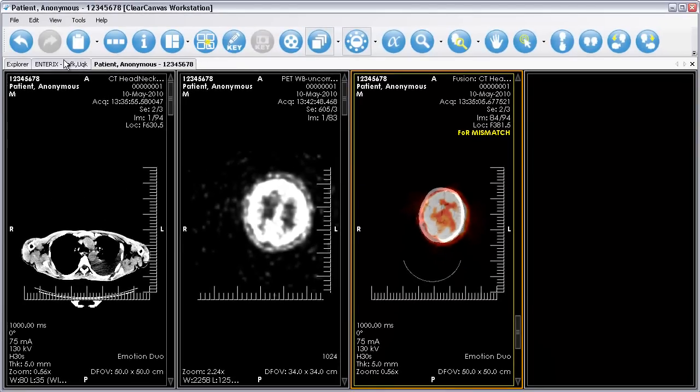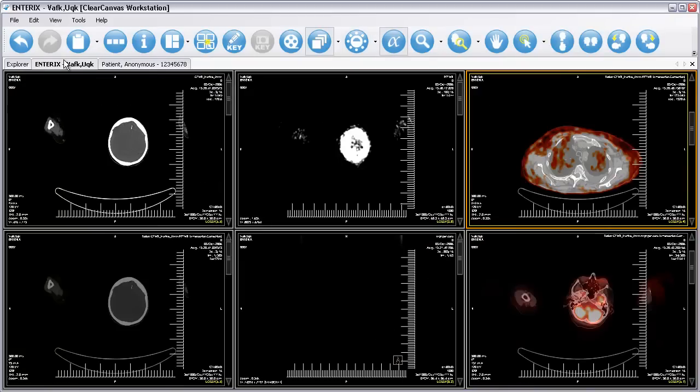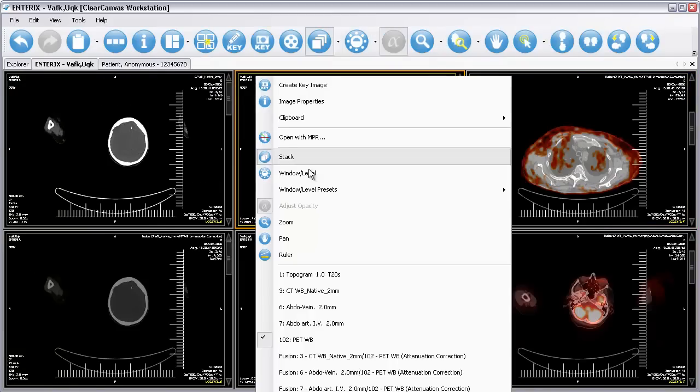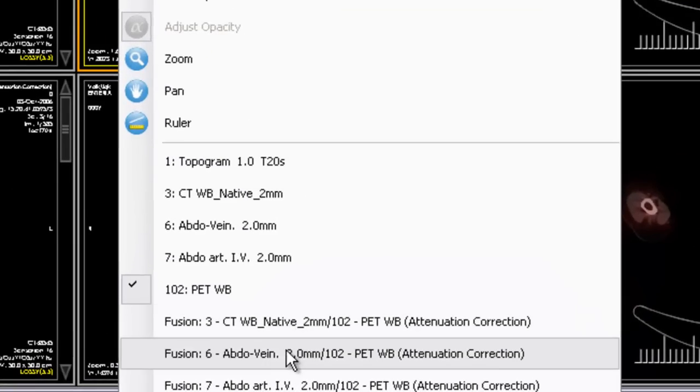Multiple PET and CT fusions can be generated from corresponding images, and each Fusion display set will appear on the context menu.